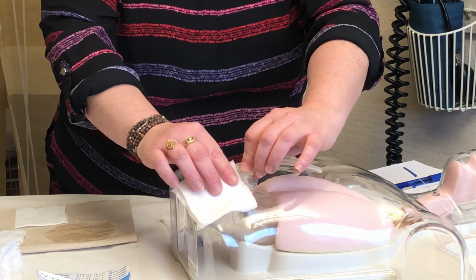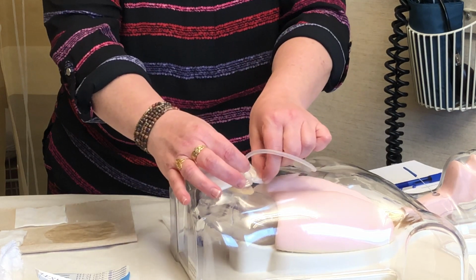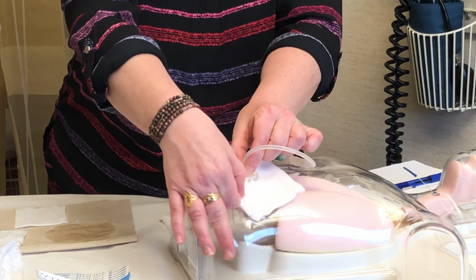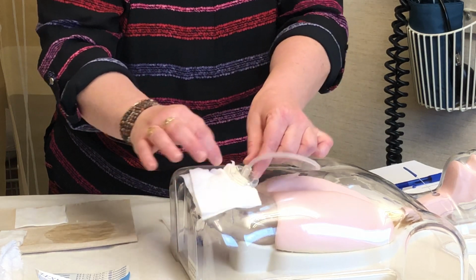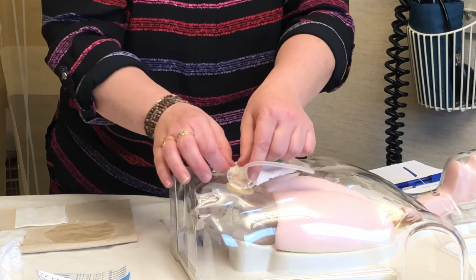First thing, lift up one end of your skin disc, the round piece here. The most important thing is to get this all the way around. Take your time, it doesn't matter which way you go. Just get that wet soapy gauze all the way around your site. And then you can discard that one.